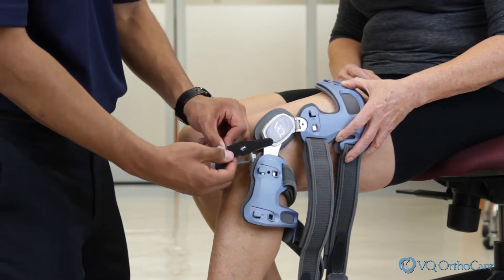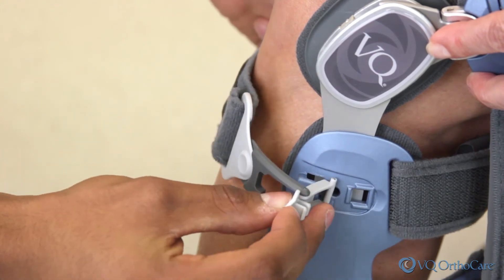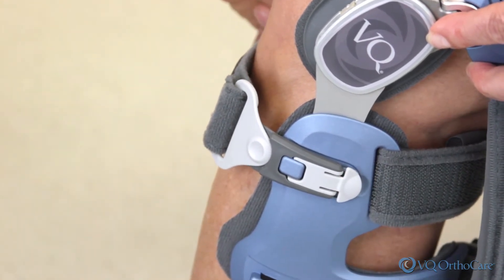Next, attach the strap buckles in the sequence indicated on the strap ends by hooking the buckle on the frame and snapping the buckle down. Be sure to securely snap the buckle into place.